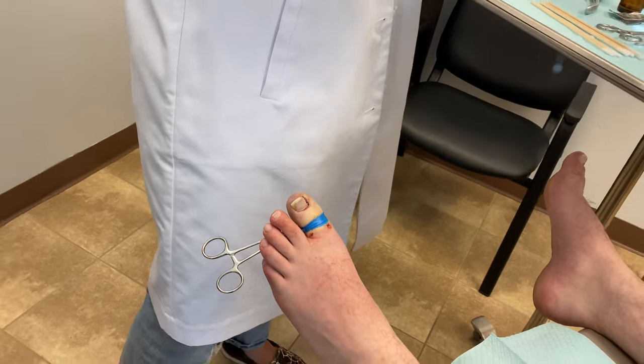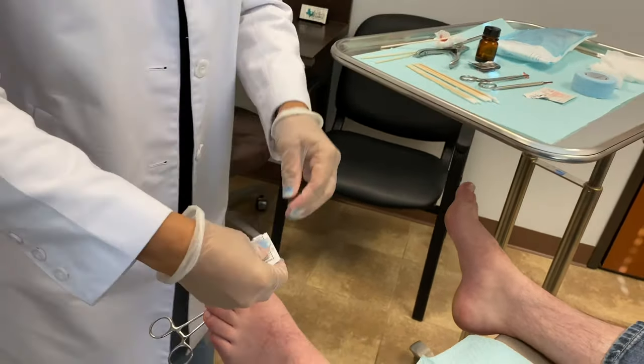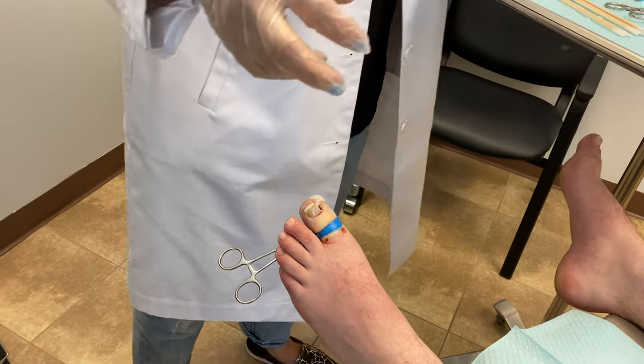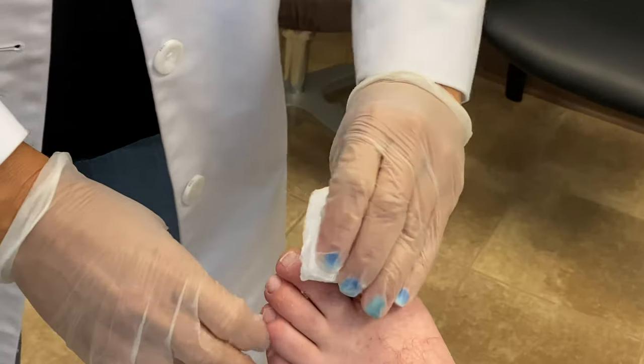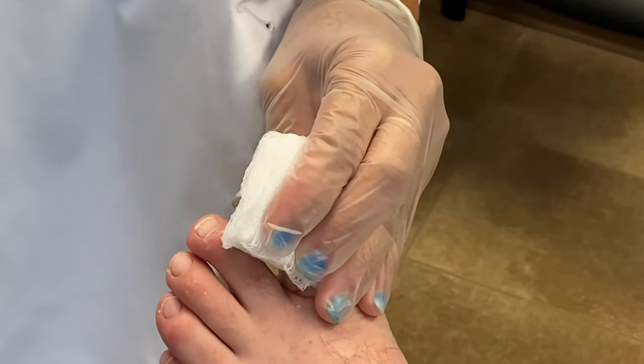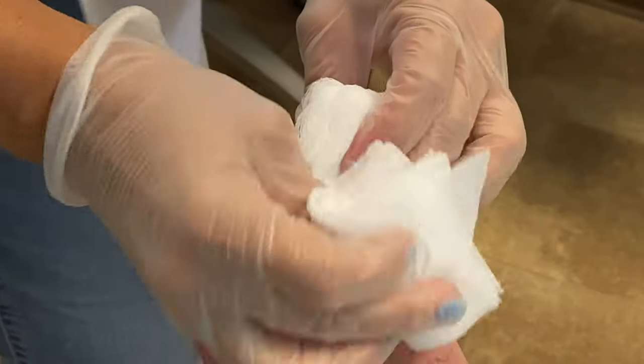Once the three cotton tip applicators have been applied, we then take a wound gel and apply it to the nail bed and place a big bulky dressing. This is to help prevent bleeding because the nail beds are quite vascular.